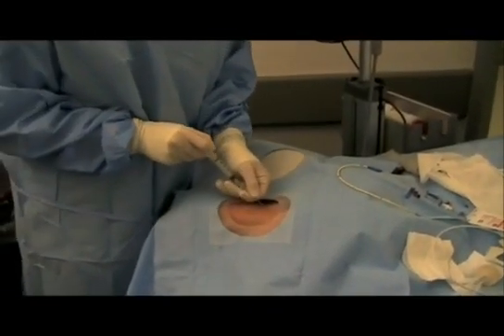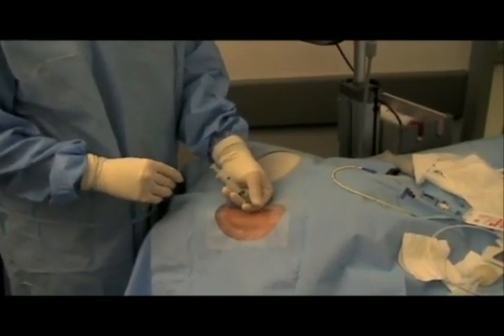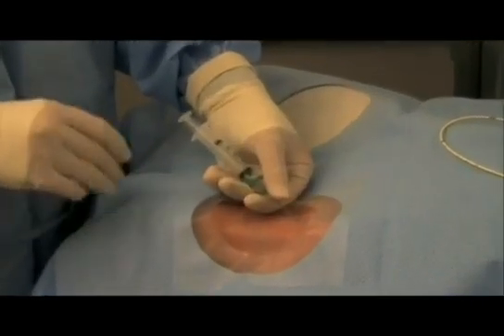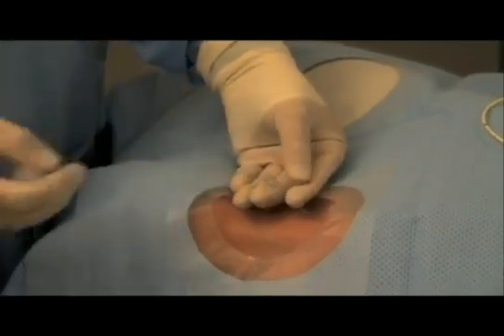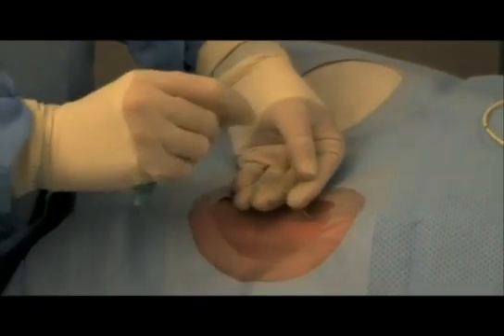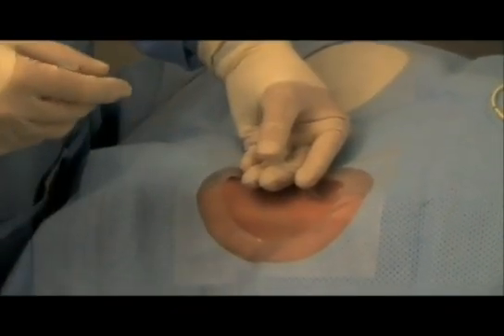You're performing your procedure and you get some blood and you're feeling pretty good about yourself, but then you look down and it's a little brighter red than you think it should be. Maybe you take off your syringe and now it's not spurting, it's not hitting you in the chest, but it's not just dripping either. It's a little more flow than you're used to and you're getting a little bit worried.